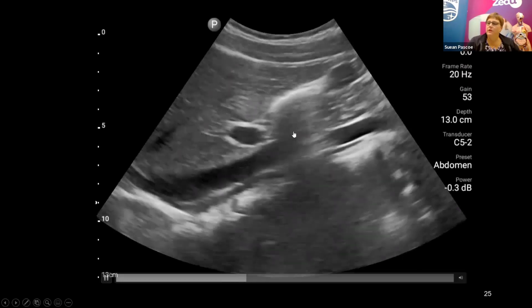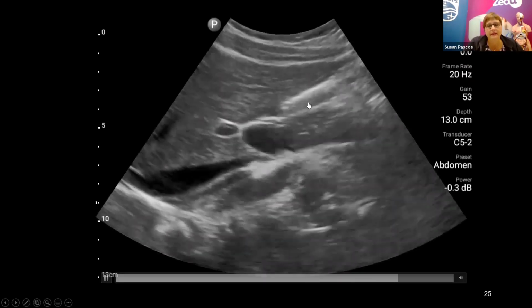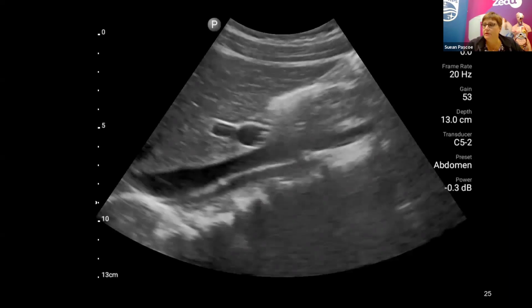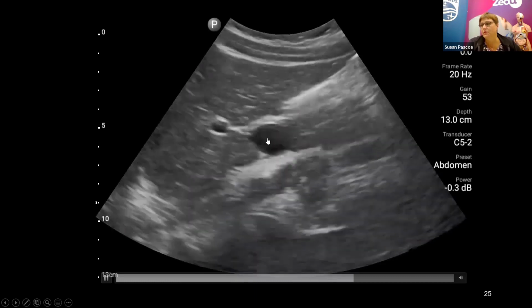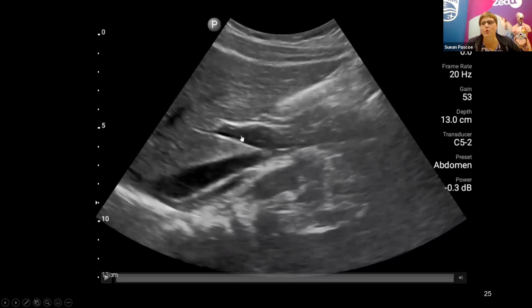Now, on this one, we've got a bit of bowel gas in the road. That can always be a challenge, and sometimes it completely gets in the road. The other thing that can get in the road is stones in the neck of the gallbladder. So if I just loop this one again, I've come out, we're into the liver now, tilt, sweep back out towards the midline, to the extrahepatic portion of the portal vein, and then we can see the bile duct draped over the top.